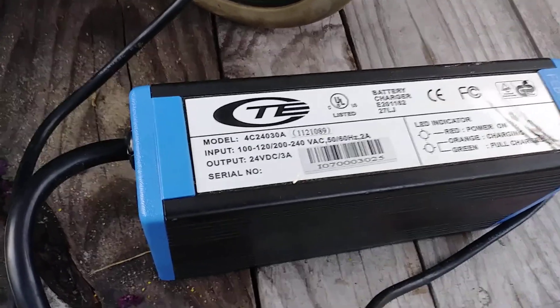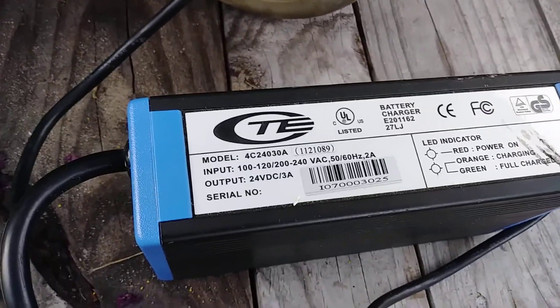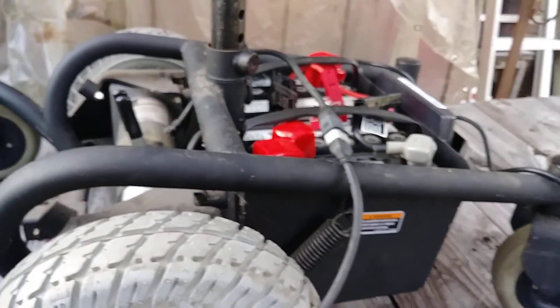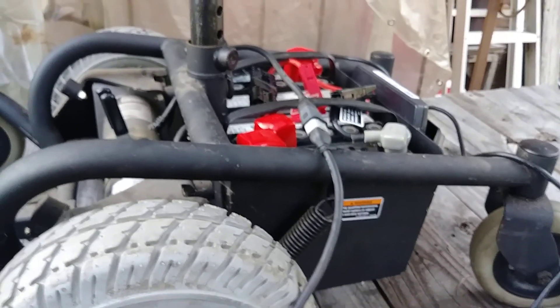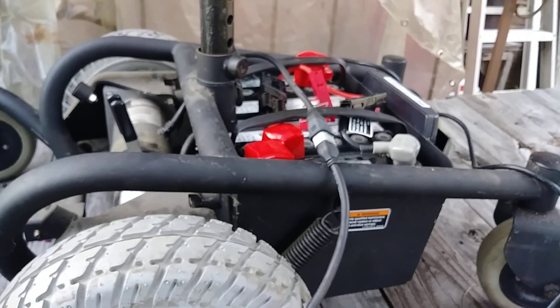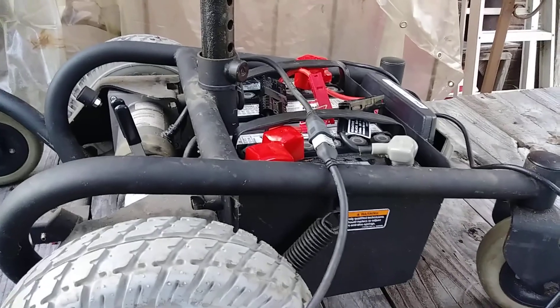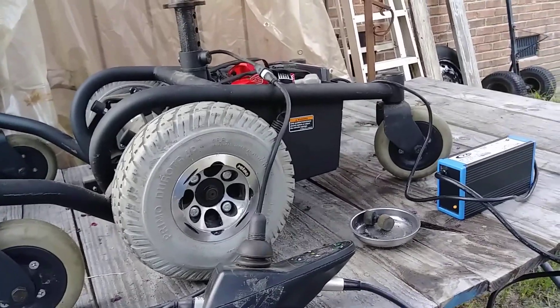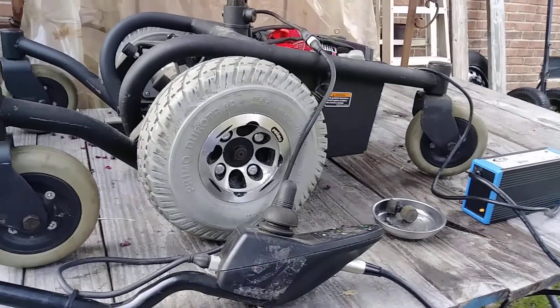What I might also try is unplugging the batteries and independently charging them with a regular 10-amp battery charger I've got. That's it on this update — it's a work in progress. Y'all take care, see ya.